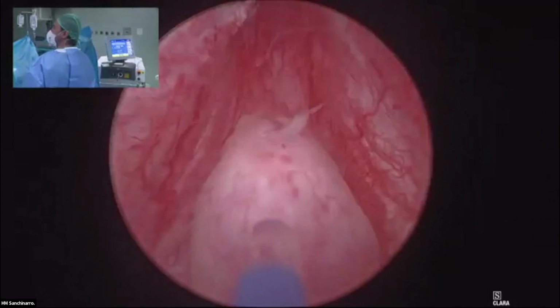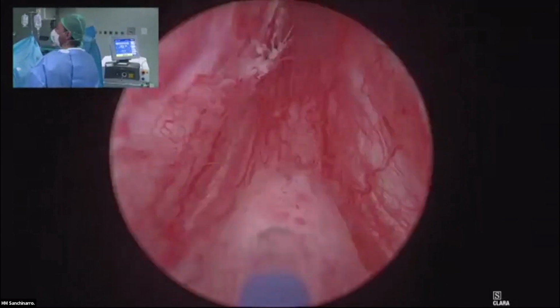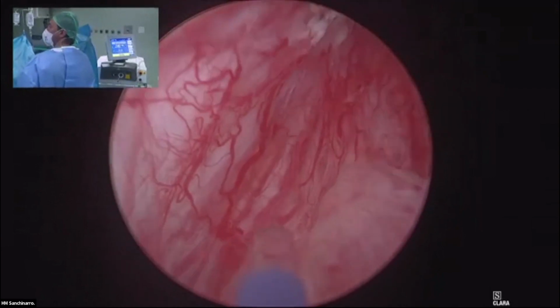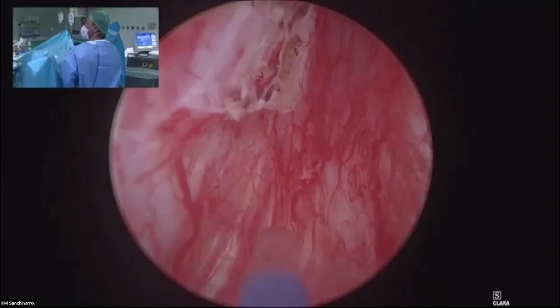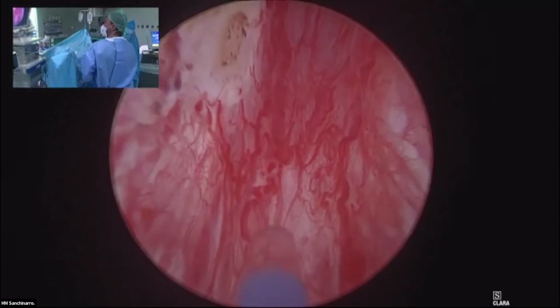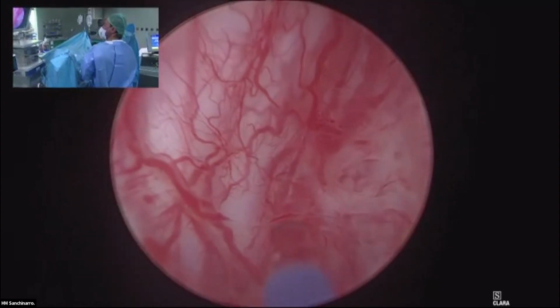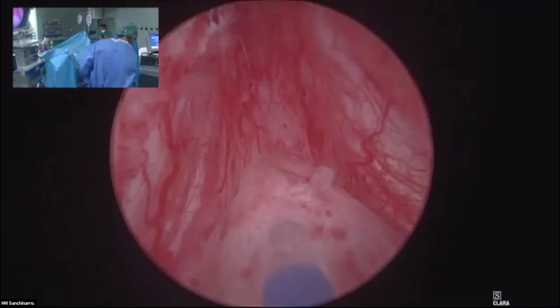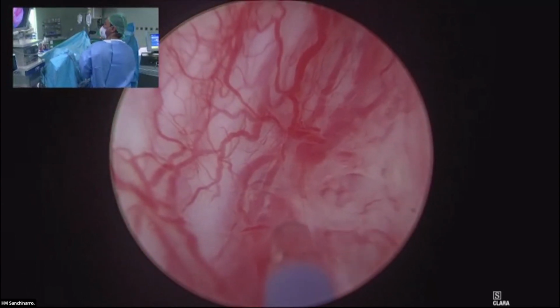Starting with my enucleation with thulium. It's a high-power thulium, so I will do it in continuous, so no more pulsed, with 220 watt, and 40 watt for coagulation. First of all, I will do a U-shaped incision, embracing the verum montanum.